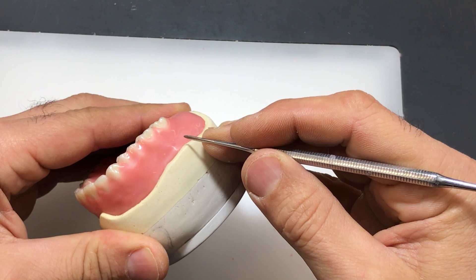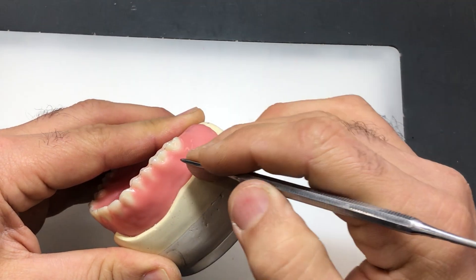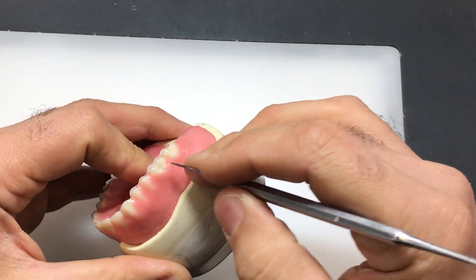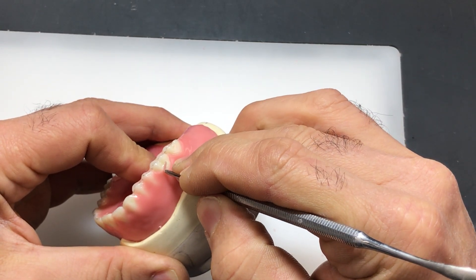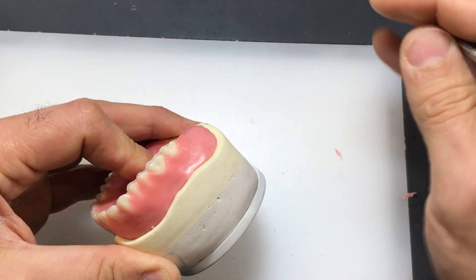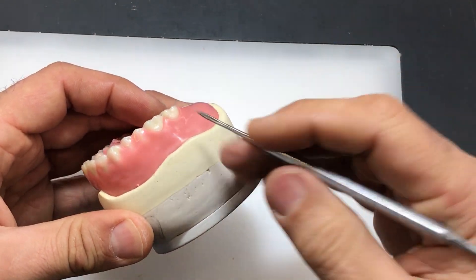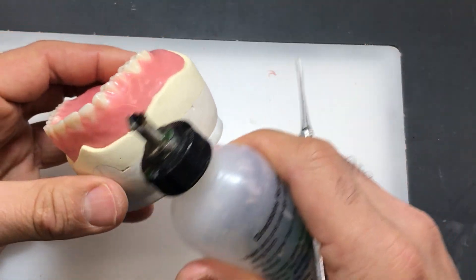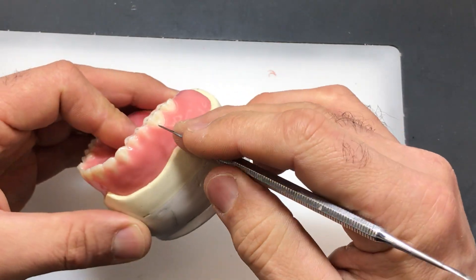It might be a good idea to anchor the case up against your tabletop and start carving around the teeth. Your initial carving is going to be a little bit longer than where your final carving is going to end up. I'm not necessarily going all the way to the cervical notch, and my interdental papilla is not necessarily halfway up the tooth — it's all the way to the occlusal third versus the middle third. I can already sense the wax cooling off, so I'm going to heat up the next section — usually about three or four teeth at a time.